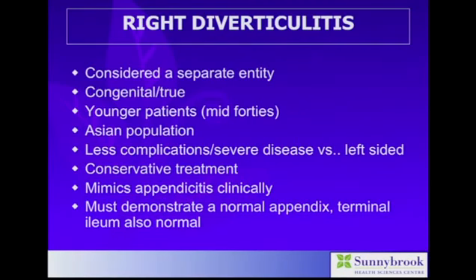Another very important point to stress is that right-sided diverticulitis clinically presents identically to appendicitis, and therefore it is up to us as radiologists or ultrasonographers to make this diagnosis on ultrasound. In addition, if these patients erroneously go to the operating room with a diagnosis of appendicitis, the surgeon's impression at the OR is often that of a mass, and the inflammation is usually so severe that the diverticulum is obscured, and so these patients go on to have an oncologic operation, namely a right hemicolectomy, for what is otherwise a conservatively treated disease. So this really is the domain of radiology.